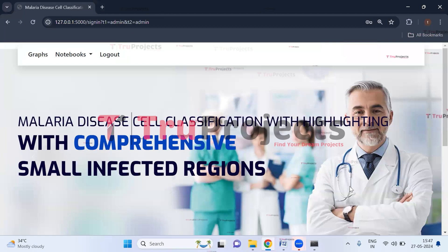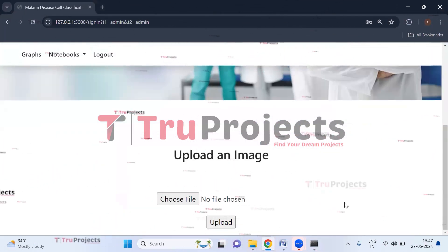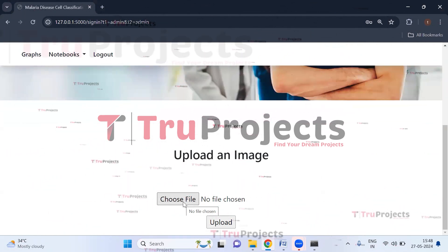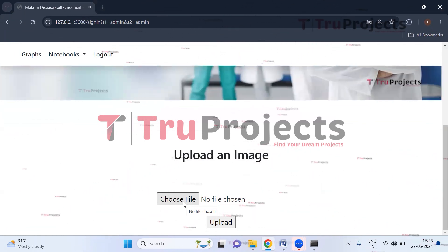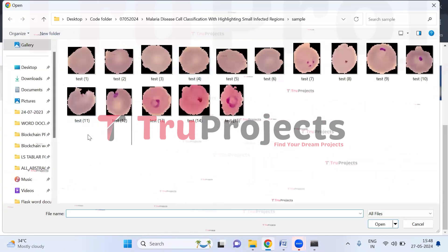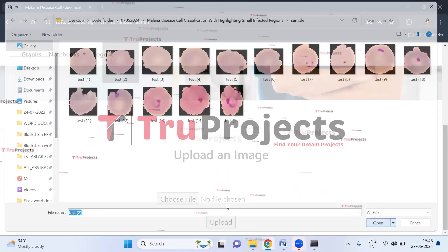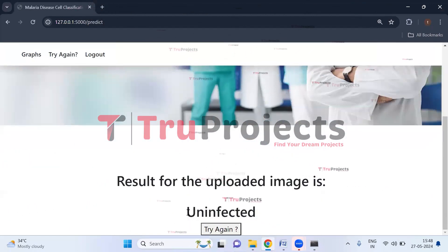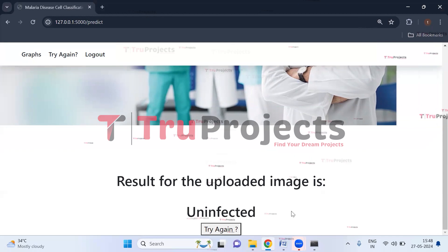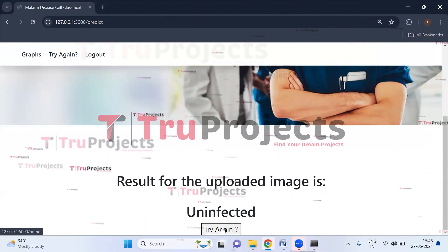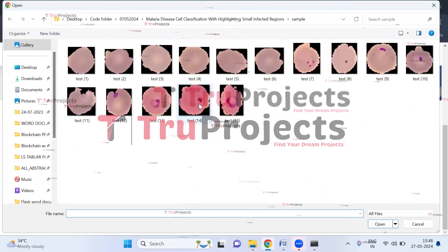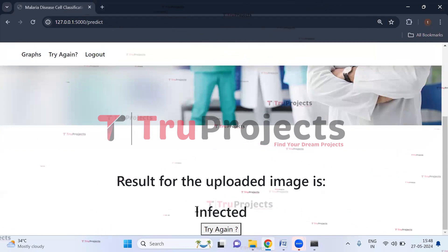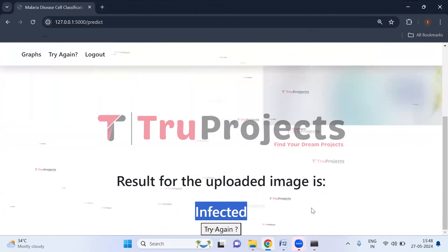We have logged in successfully and are redirected to the prediction page. Here we need to upload RBC images, and the application will predict whether the cell is infected or not. Clicking 'Choose File,' I select the second image from the test cases and click Upload. The result shows 'uninfected,' meaning it is a healthy cell. Clicking 'Try Again,' I upload another image and the result shows 'infected' — it is a malaria-infected cell.